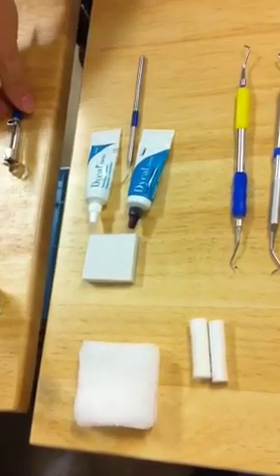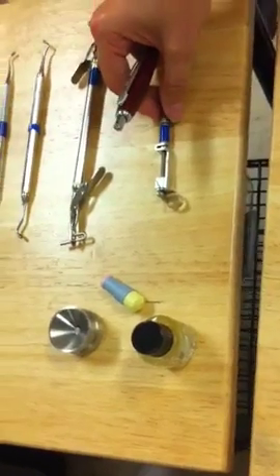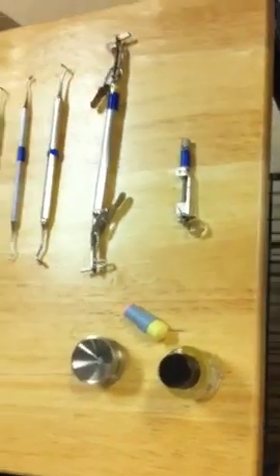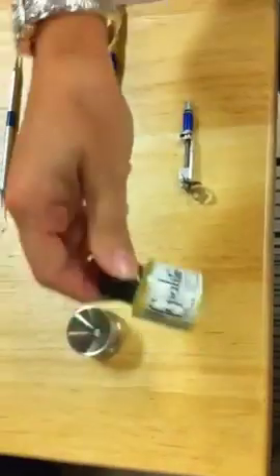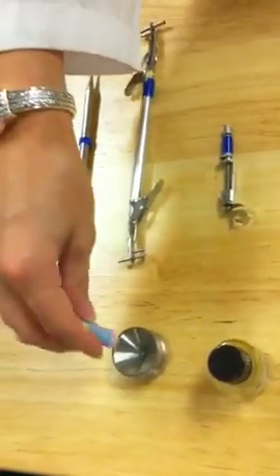If you're doing an interproximal filling, you'd be placing the Tofflemire matrix band and wedge. And you're going to use a cotton pellet and apply some Copalite, which is a cavity varnish, which seals the tubules of the teeth. You're going to get the amalgam and put it in the triturator. It's going to mix the amalgam, and you're going to dump it into the amalgam well.